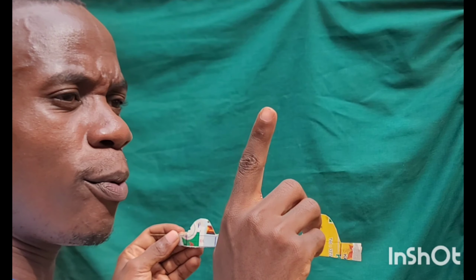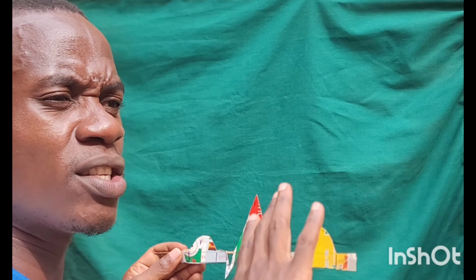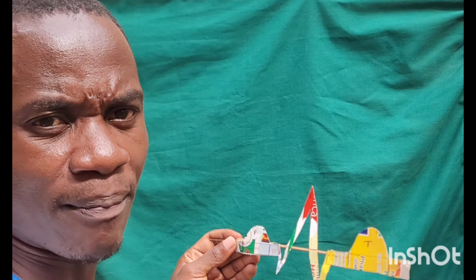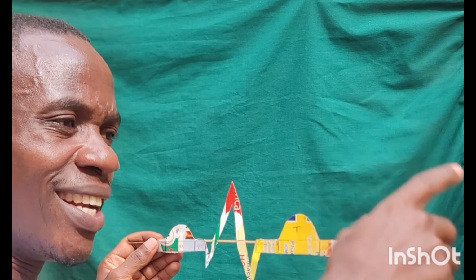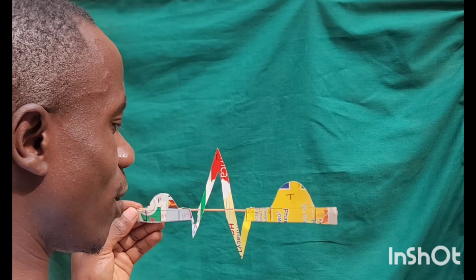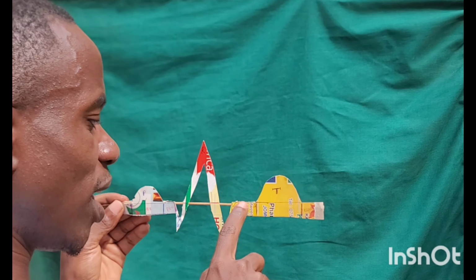The galvanometer pointer is going to come back to the neutral position, because there is not going to be any electromagnetic force generated at that time. Okay, so now this ST segment denotes that the entire ventricular myocardium is completely depolarized. Okay, it is also such another beautiful thing to know.